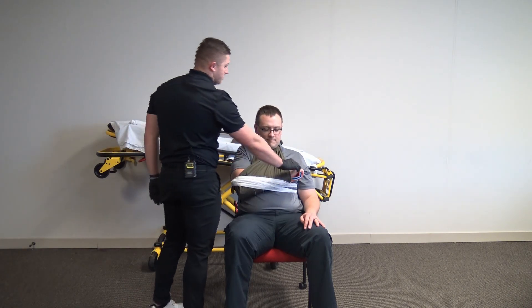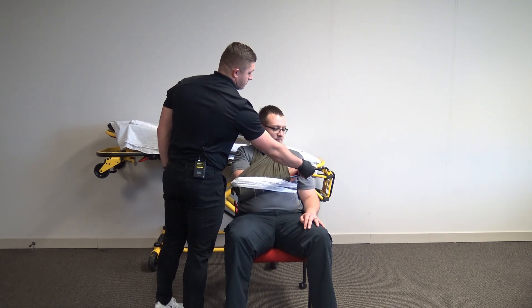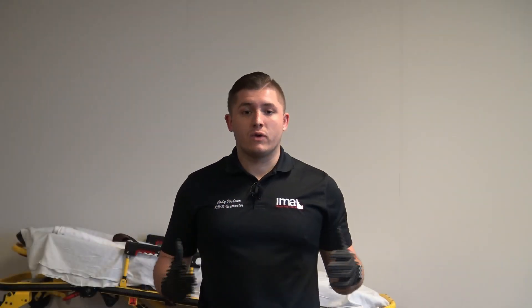Alright, now I have everything immobilized and secured. I'm going to check CMS again. Sensory — can you feel me touching? Can you wiggle your fingers? I've got motor. I can't check a pulse, so I'm going to check cap refill — which I do have. That would be the end of my test. Okay, that was the testing scenario, exactly what it should look like when you're testing off in class. Now let's break that skill sheet down step by step.